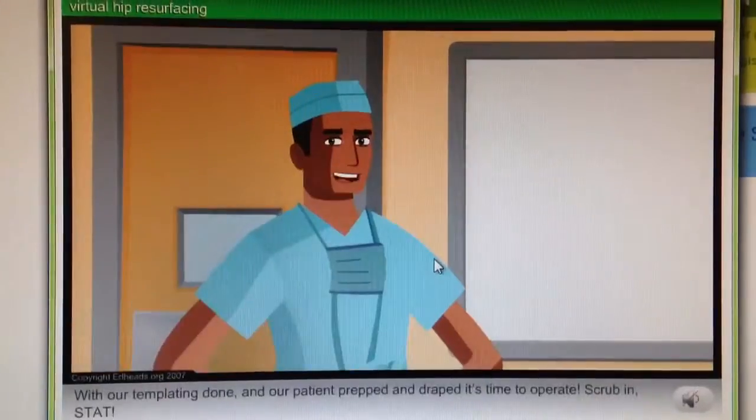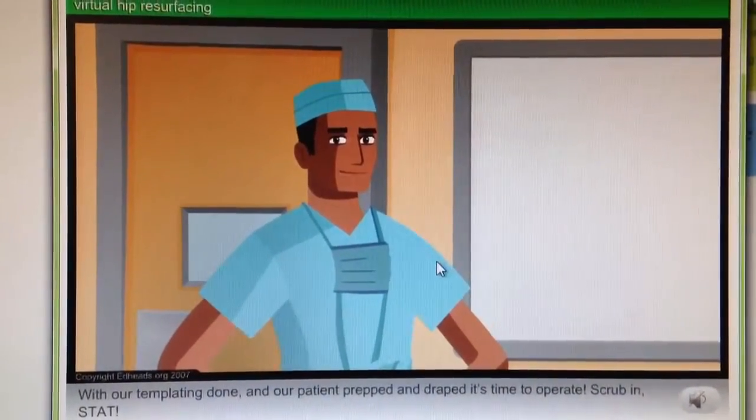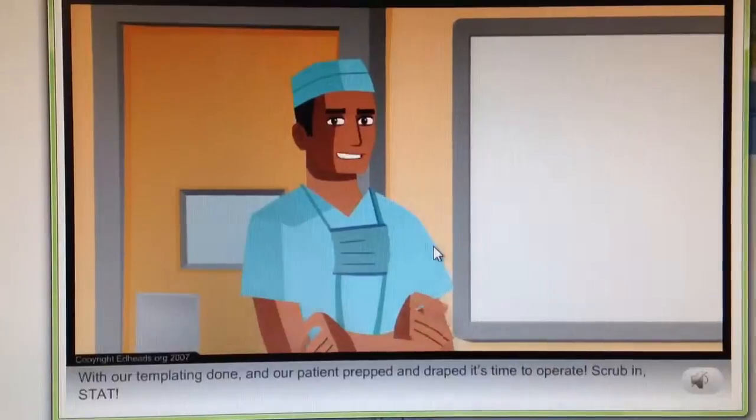Yes. With our templating done and our patient prepped and draped, it's time to operate. Scrub in, stat.